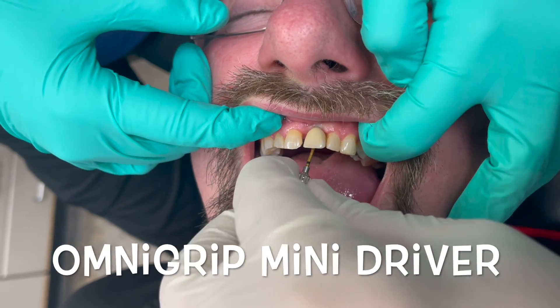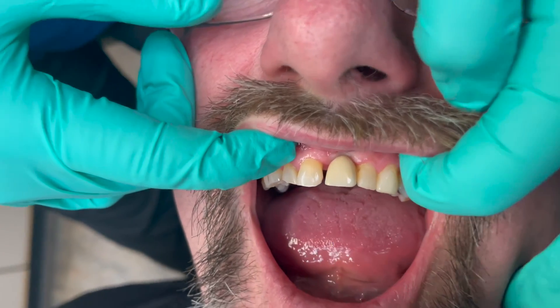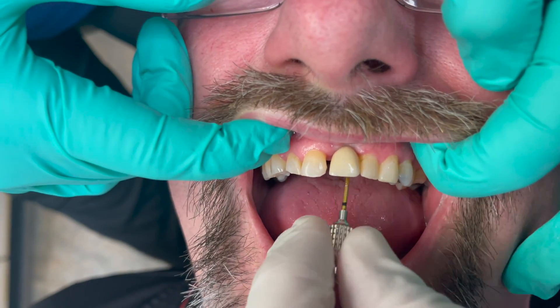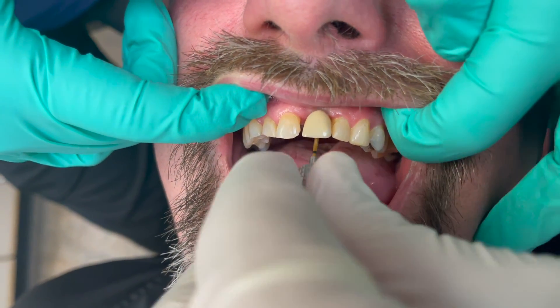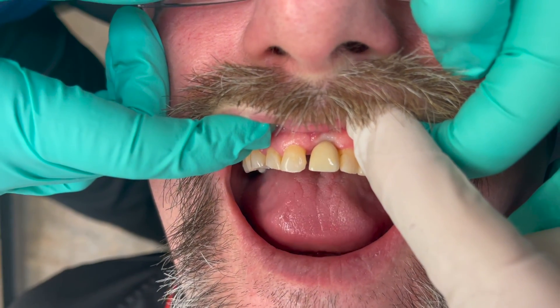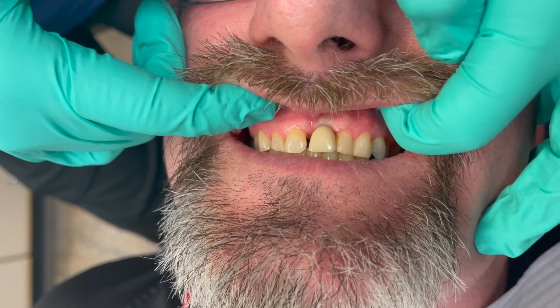I'm going to hand tighten this down and get it into position. This is an N1 ASC crown — angulated screw channel. My favorite way to restore this implant is with the base and then an angulated screw channel on top. Just trust me — do it that way and you don't need to go to the implant level. It costs less to do it this way as well, because you're not putting in a titanium abutment, and there's no cement either.